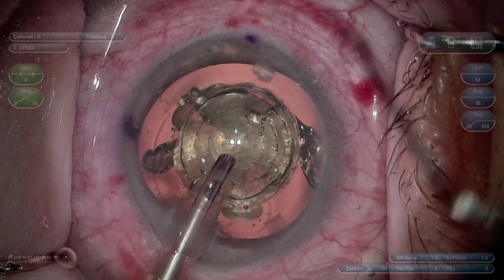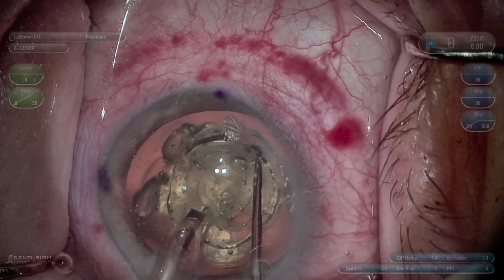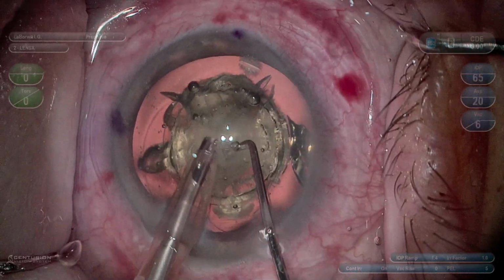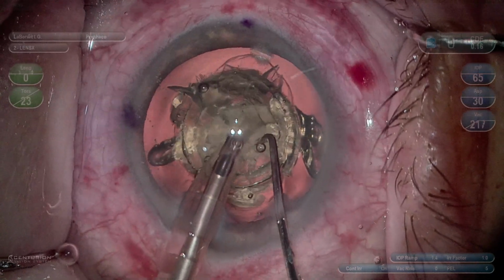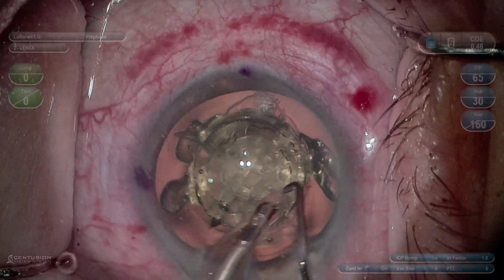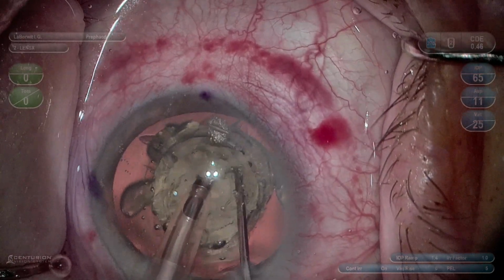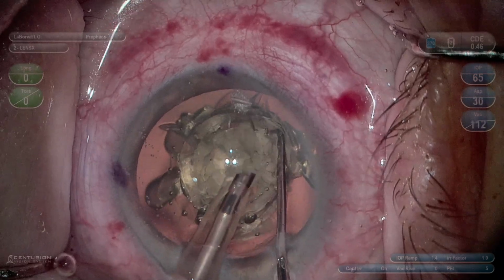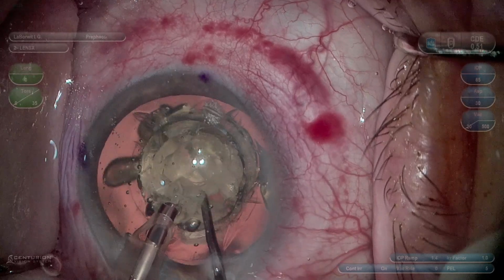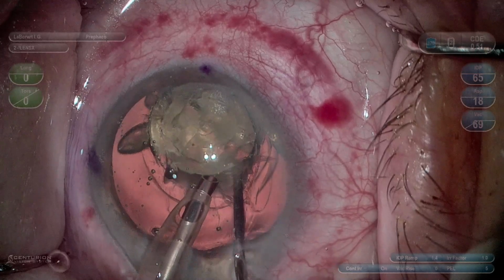So here we are with a patient that has a 4.7 cylinder pattern and a horizontal cut that extends beyond the last cylinder by 22 microns. And then we also have it at 60% depth of the cut nucleus. So you'll pay close attention to my phaco tip and notice it never truly leaves the central area of the nucleus, so it doesn't go beyond the capsulotomy. And I'm using my second instrument to just flick pieces up of the laser cut nucleus.